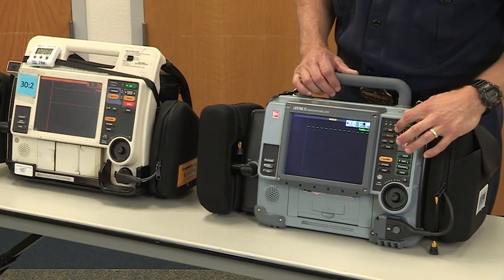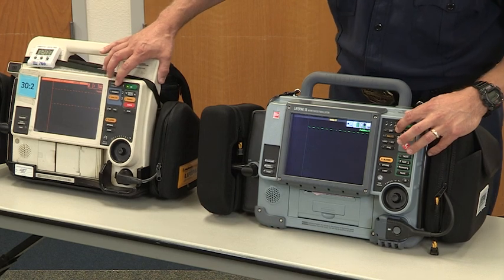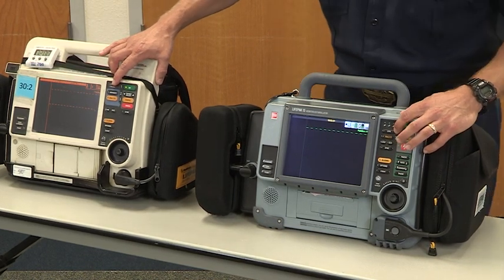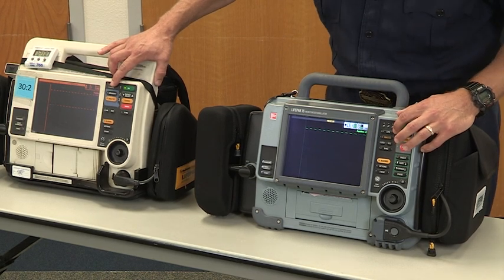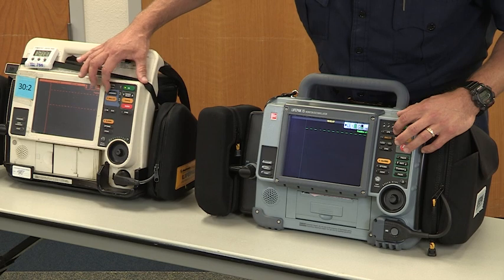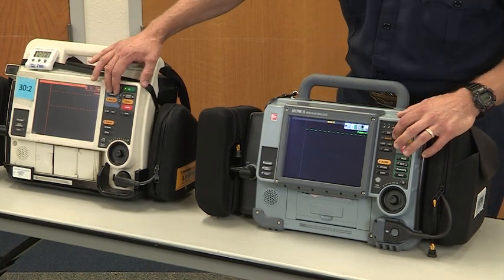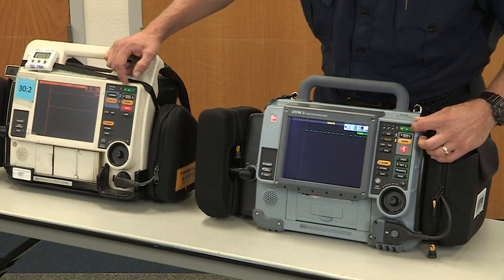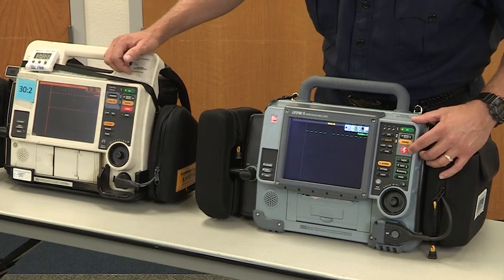There's a CPR button on the LIFEPAK 15 where there's no CPR button on the LIFEPAK 12. The CPR button on the LIFEPAK 15 allows us to use a metronome during CPR that we can turn on and off in either manual or A.E.D mode. You'll notice on the LIFEPAK 12 there is an advisory button, and they've done away with the advisory button on the LIFEPAK 15. All the buttons, the on, energy selection, charge, and shock button are all the same.